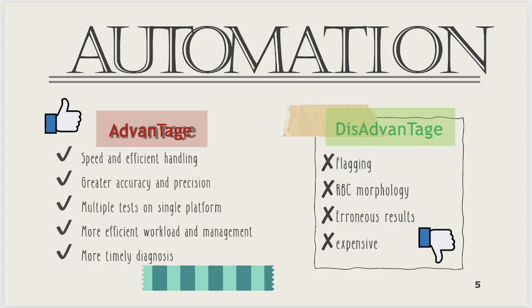So what you'll do, of course, is now your manual examination. Kumbaga, automated ka na, nagmamanual ka pa because you have to double check. So that's the disadvantage, your flagging. Comments on red cell morphology cannot be generated. Your RBC morphology cannot be generated.